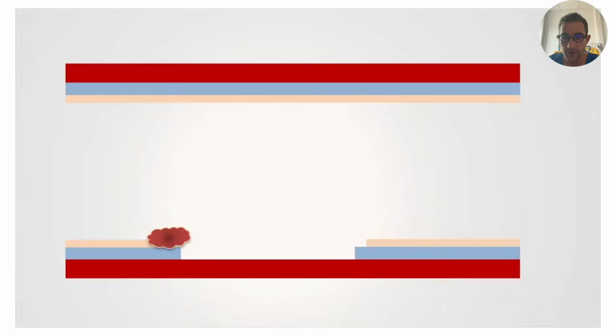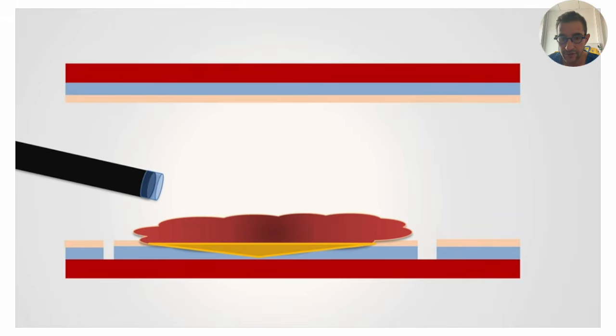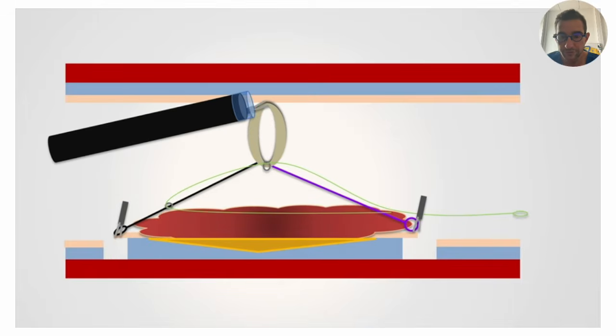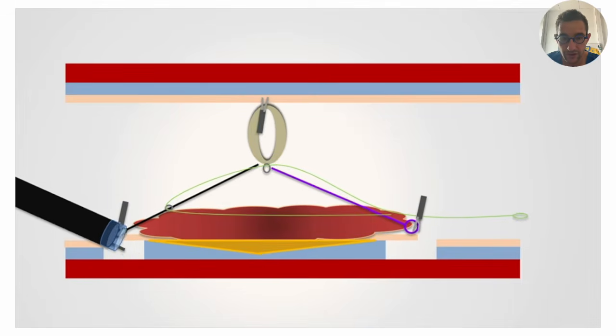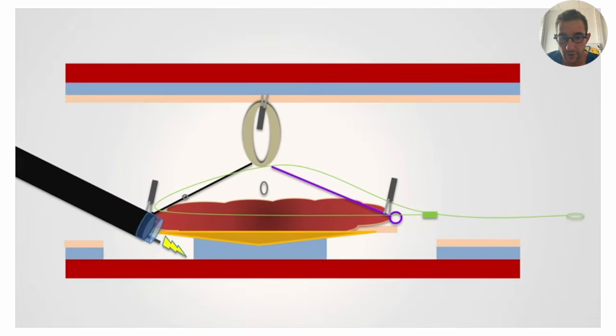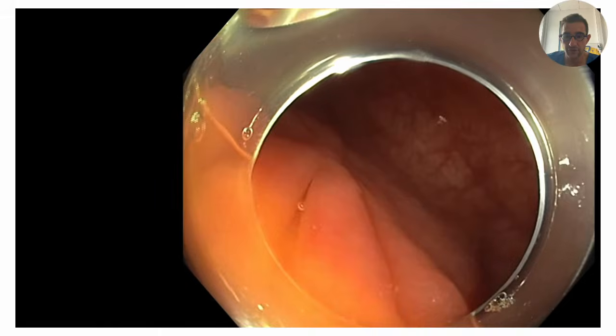So finally, the complete strategy is here. You have the scar and the recurrence. We use a large incision. We use a strong traction. And then when the field is very small, we traction again to enlarge the space and remove the lesion.